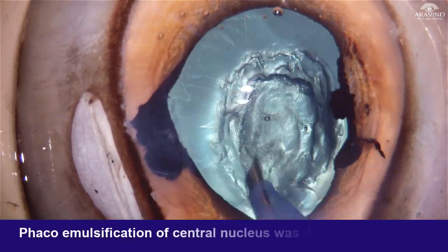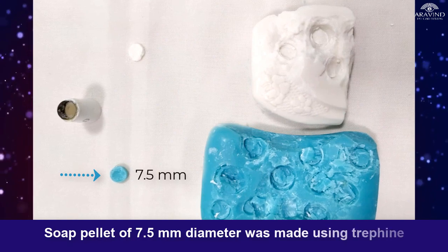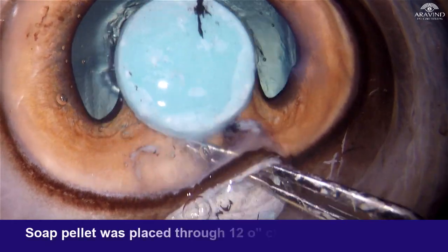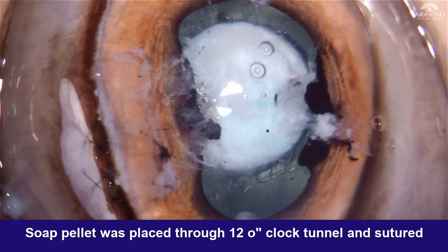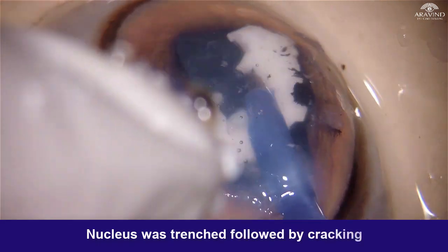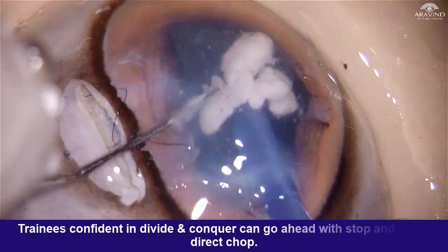Capsulorhexis of 5.5 mm can be done either through the side port or through the clear corneal entry. Phacoemulsification of the central nucleus was done forming a crater. A soap pellet of 7.5 mm diameter was made using the trephine. The soap pellet was placed through the 12 o'clock tunnel and was sutured. A side port was made at 11 o'clock position and the nucleus was trenched initially, followed by cracking and emulsification subsequently.